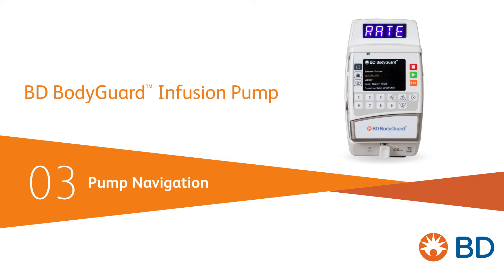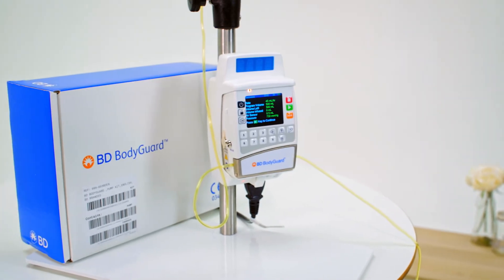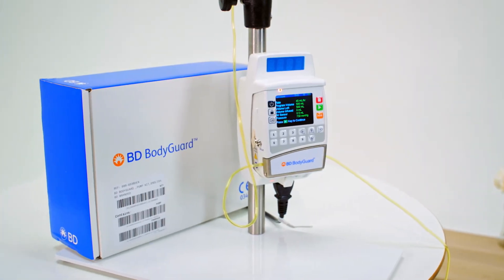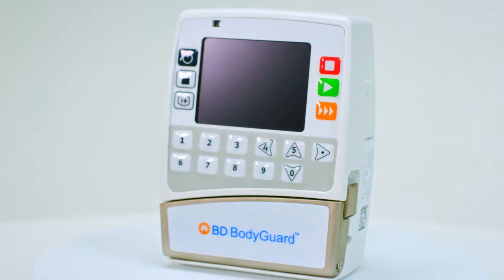Clarity and ease of use were crucial objectives for the design of the BD Bodyguard infusion pump. Our last video explained the basic setup before commencing infusion. This video outlines important steps to familiarise yourself with the pump's interface.